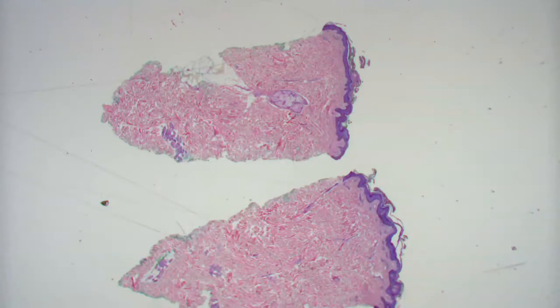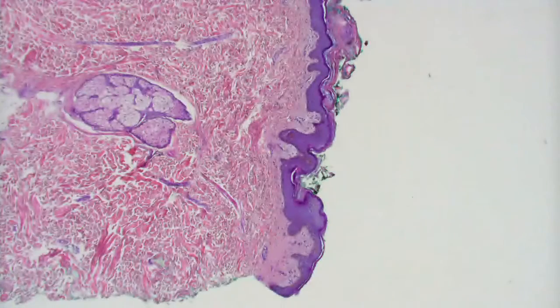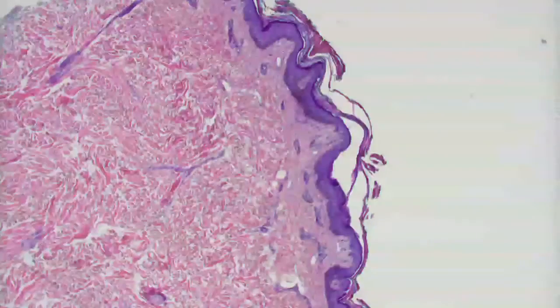Okay, so we have a punch biopsy of non-acral skin, and the dermis really didn't tell me very much, but the epidermis looked a little bit papillomatous. Yeah, there's a slight amount of acanthosis here. I would agree with that. Where's the main pathology this time? I think, well, there's a slight superficial perivascular infiltrate. Yeah, it's very subtle though, isn't it? Yeah, in the other cut maybe it's a little bit more noticeable, but it's subtle.